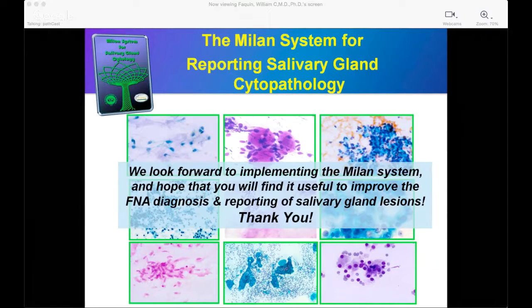So he says that unlike gynecologic cytology and to some extent thyroid cytology, salivary lesions are a group of diverse lesions. So he believes that benign versus malignant and then low versus high grade would have sufficed. And he is wondering how risks of malignancy were determined for these classes from such a diverse group of lesions.